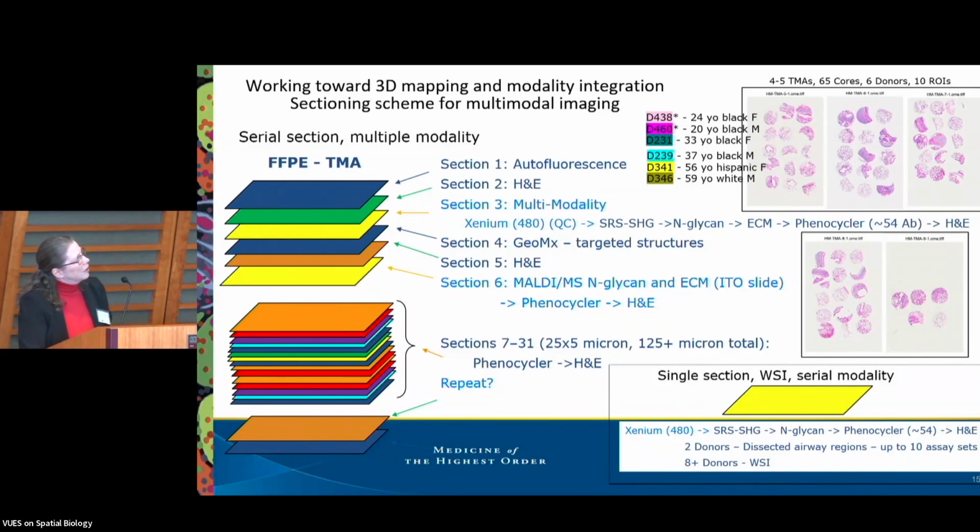So we also have used tissue microarrays that you see there, 5 separate ones of them. These are very small. They're about 3 millimeter cores, but they allow us higher throughput at a lower cost, and will give us relatively small data sets. Will generate over, I'll tell you that in a second.